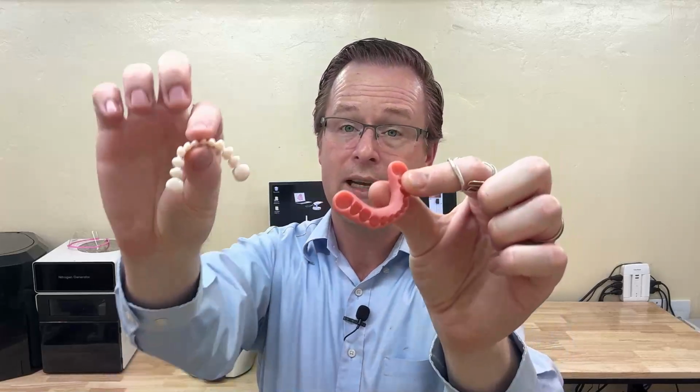Again, just some different examples of why you would want to use this workflow, but our ultimate goal is we're going to create from our original monolithic design a two-piece printable or millable prosthesis. Let's go ahead and jump right in.